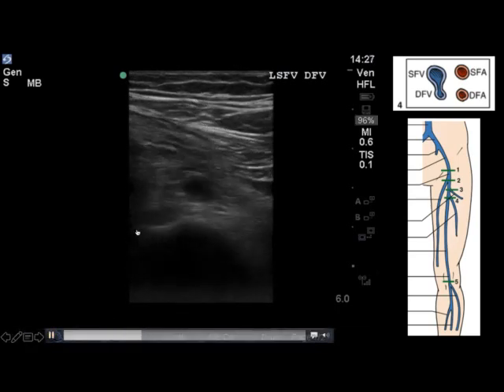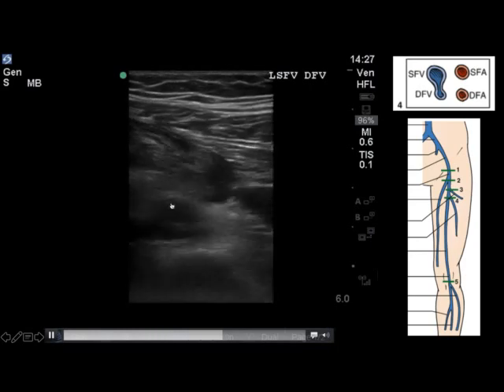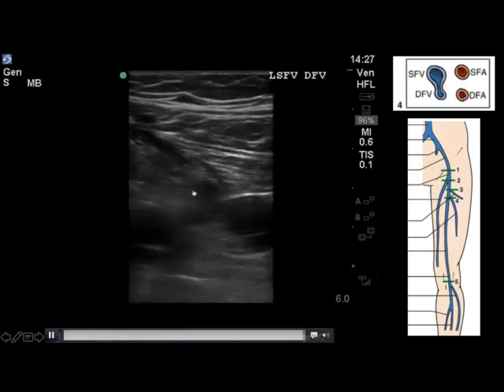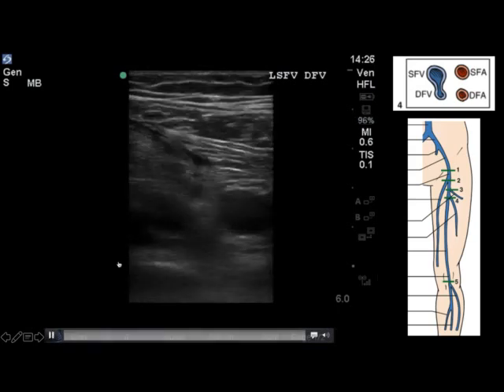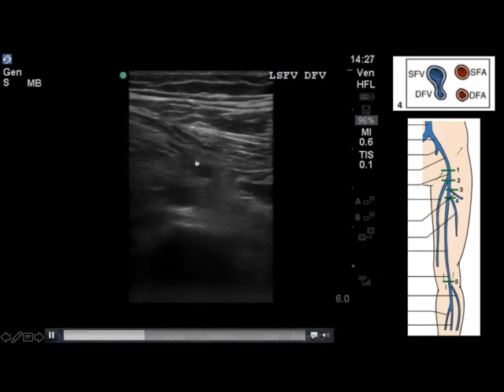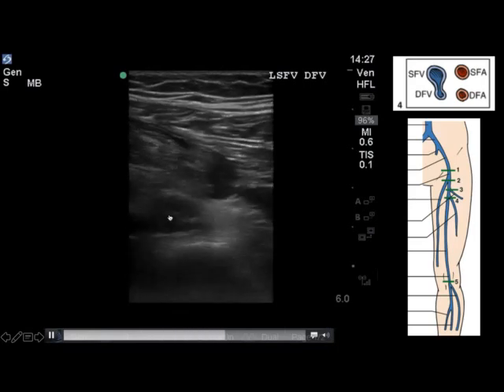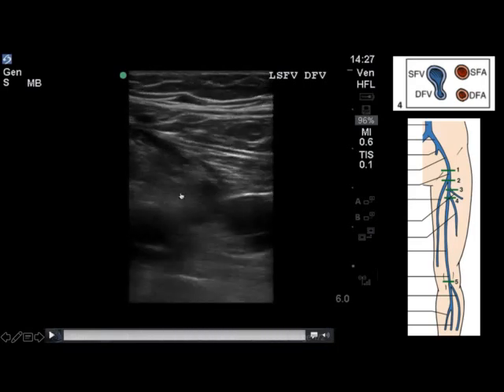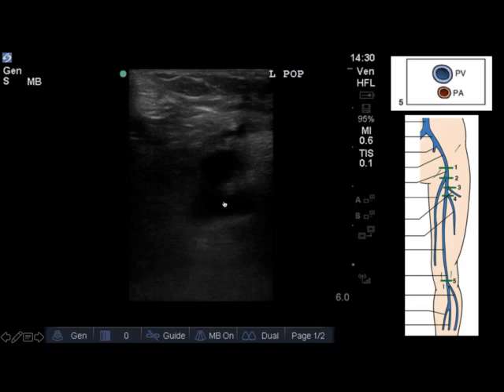The next point we look at is the bifurcation of the common femoral vein into the superficial femoral vein and the deep femoral vein. There's a little bit of artifact present, but nonetheless you're able to see that we can fully compress both the superficial and deep femoral veins at this point of vascular bifurcation. These lie medial to the femoral arteries, and we're able to satisfy ourselves that there's no clot present in this area.